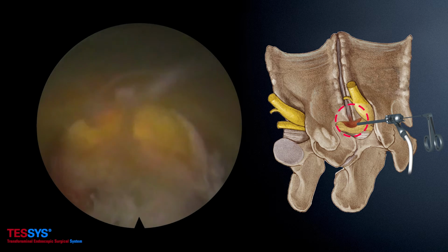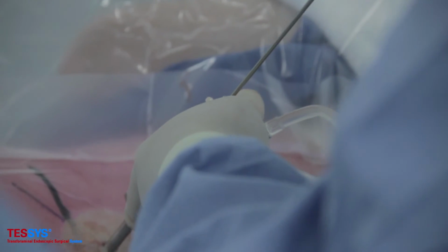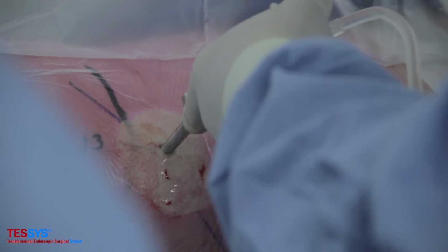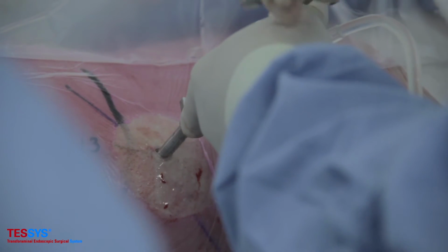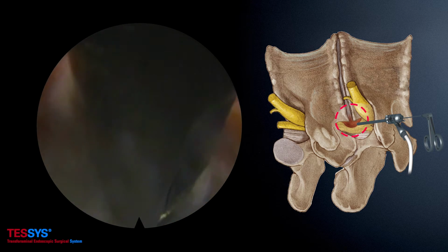With a 30-degree foramenoscope, with a view angle of 74 degrees, we look upwards. In this position, the patient is laying on his right side, the head is at the right side, and the legs are on the left-hand side. In the direction of 12 o'clock, we see the foramen.